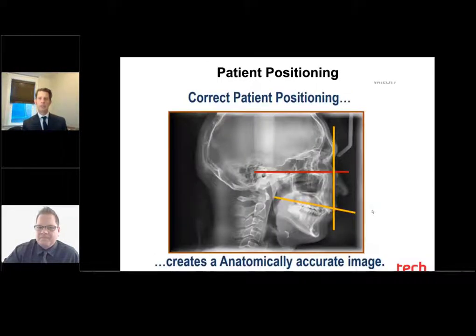Right. So here's really what we're looking for in a properly positioned SEF. Gently closing on the back, standing up. You can see that spine is straight up and down. Nasion bar is proper. And then patient's lined up proper there. Yep. Great.